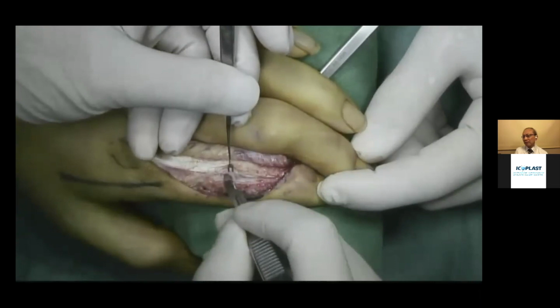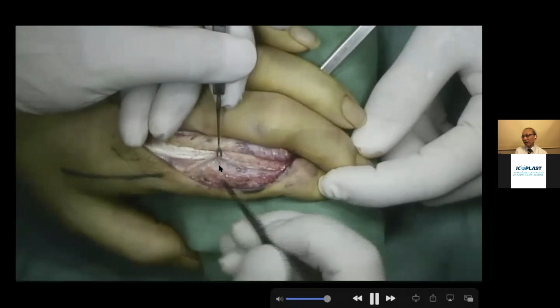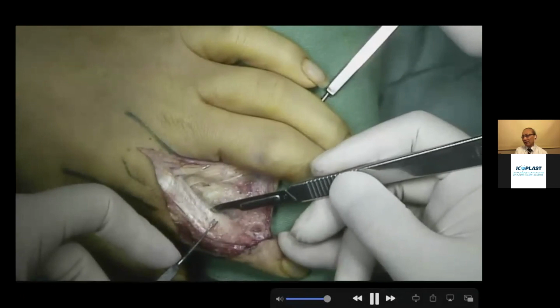But if you meet some injured tissue, hardened tissue, fibrotic tissue, try not to use the dissector to elevate it; still use the scissors. That makes a sharp and nice dissection of the extensor tendon. But of course, not every case could have an extensor like this. Some of the cases have injuries, and you find that the extensor quality is poor.